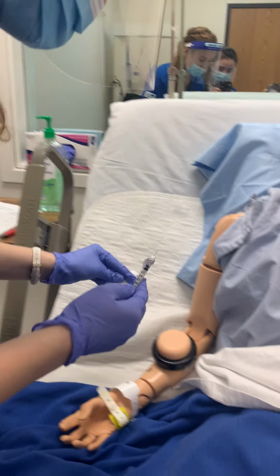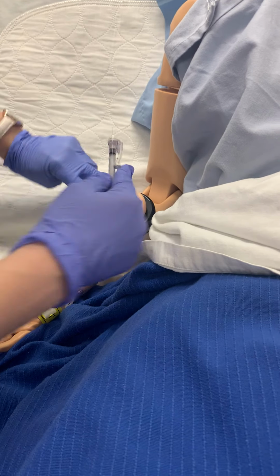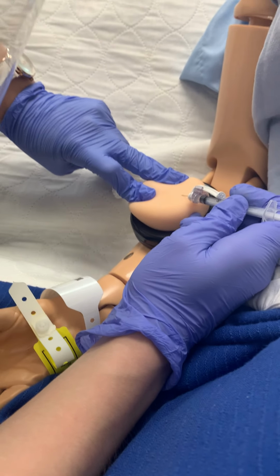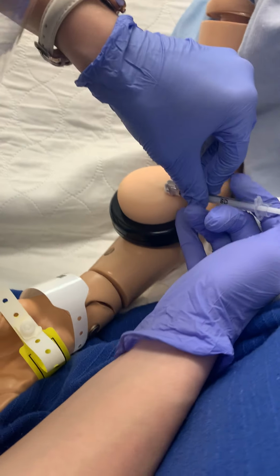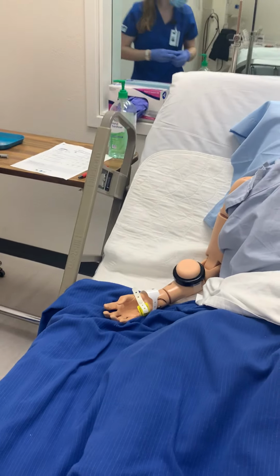Perfect, Shirley. How are you doing? Doing good? Let me just get this. And then I'm going to make sure my bevel is up. And I'm at a 15-degree angle. Okay, 1, 2, 3, sorry. And then I'm just going to be making a little bleb. As you can see, that's kind of hard to see, but my bleb is right there. How are you doing, Shirley? And I'm going to be putting my safety on, putting it in the sharps container.